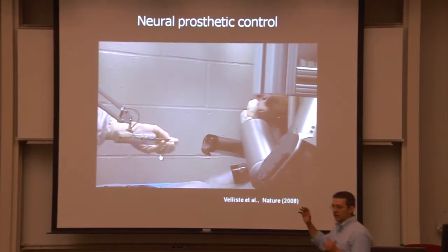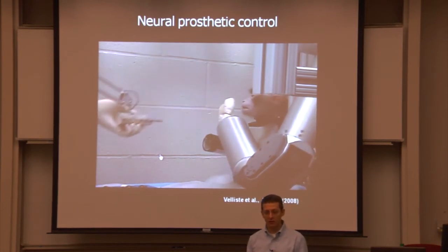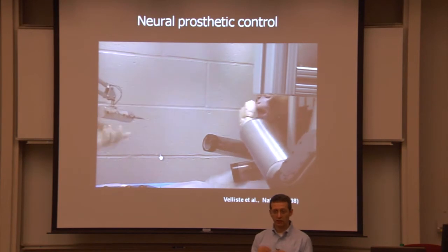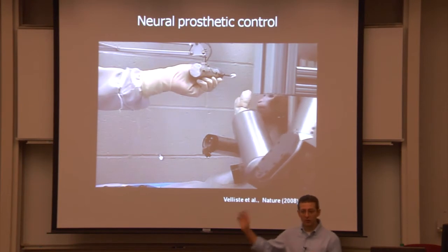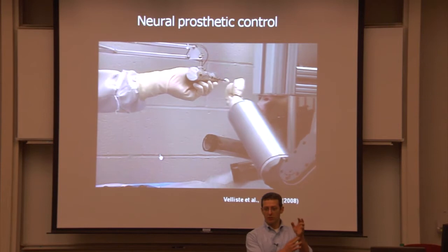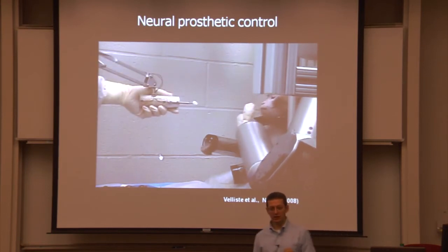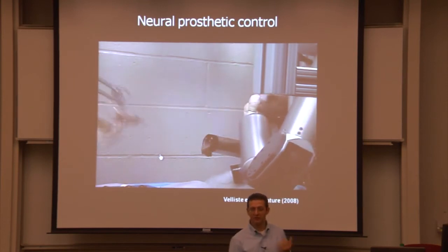So for those of you who haven't seen it, this is what one of these devices actually looks like in action. This is a video released by the Schwartz Lab back in 2008. And they have a monkey implanted with one of these Utah electrode recording arrays. It's recording about 100 neurons in primary motor cortex. And they're using those signals to drive this robotic arm. And the monkey is controlling both the 3D endpoint position of the robotic arm as well as the 1D gripper aperture of the arm. And when you have a highly motivated subject, as this monkey is because he really loves marshmallows, then the subject can learn to use this device to do something useful like feed himself marshmallows.